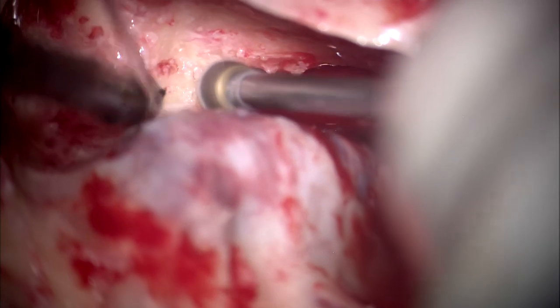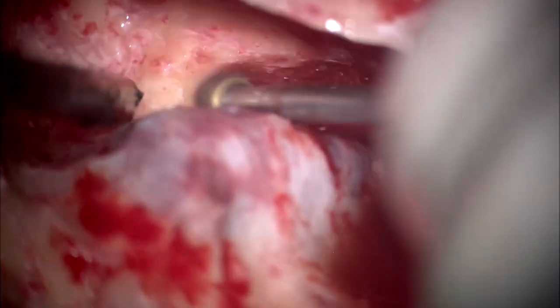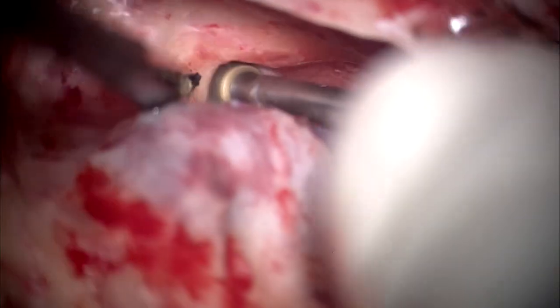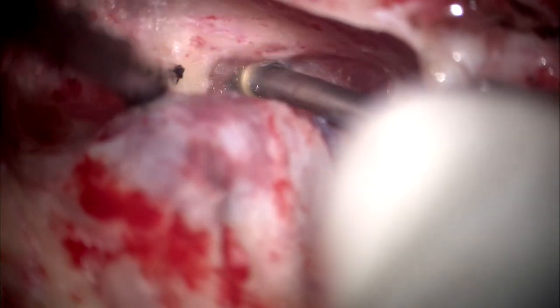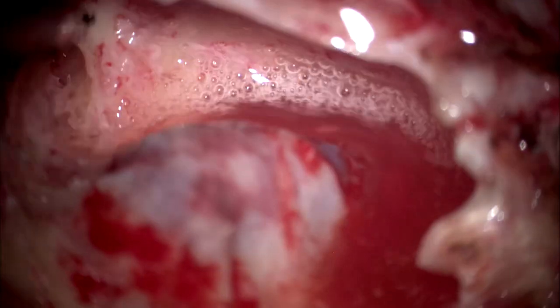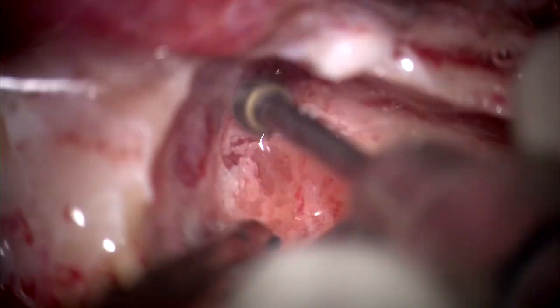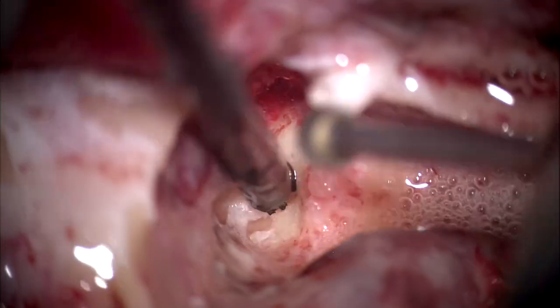This is my posterior semicircular canal. This thick bone is the posterior semicircular canal. That is your jugular bulb below. And these are all still the retrofacial cells. Now, let us define our other semicircular canals. Translabyrinthine means it is going to go through the labyrinth. See, all these supralabyrinthine, perilabyrinthine cells have to go, all bone has to go.